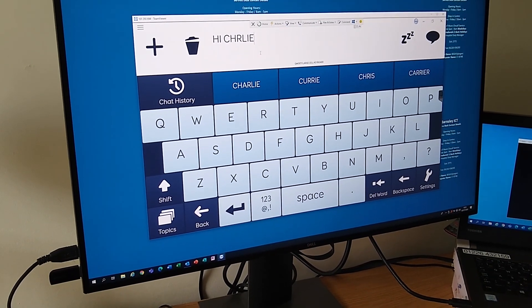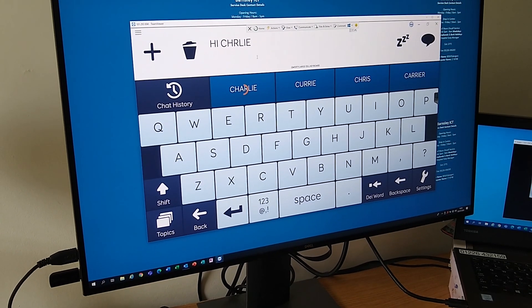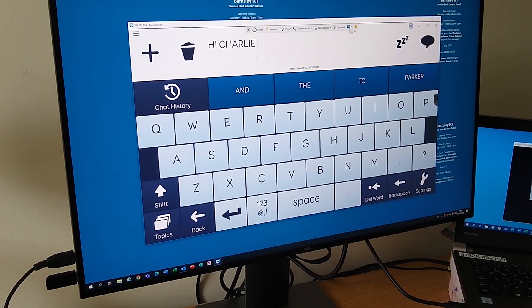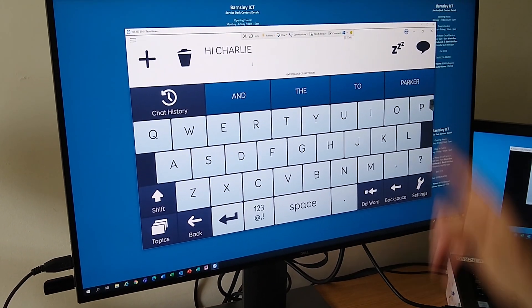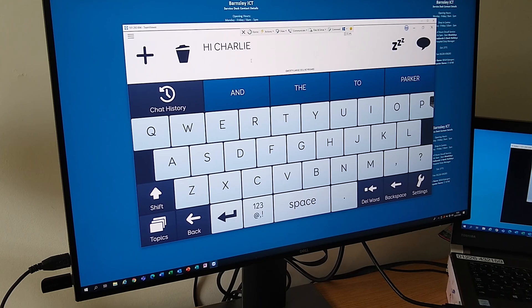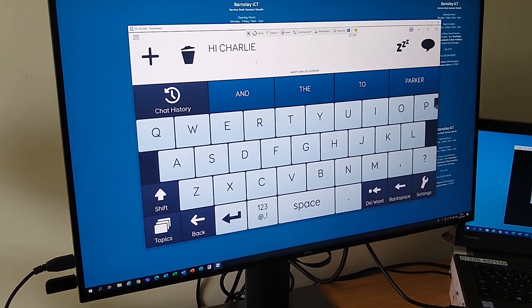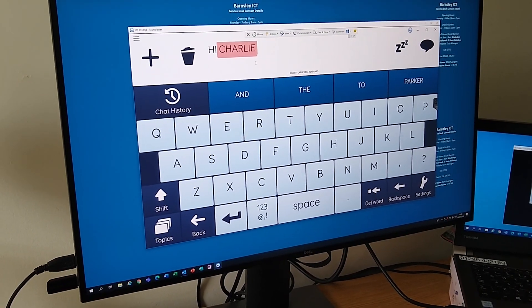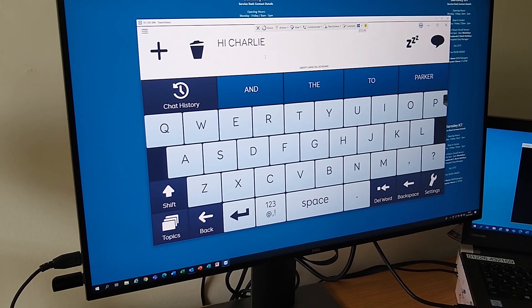You can use the prediction cell there if you want. Great. Do you want to read the message out by going to the speech bubble? Great, thank you very much, Alison.